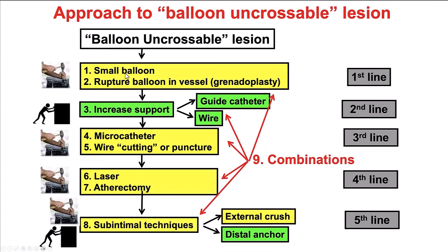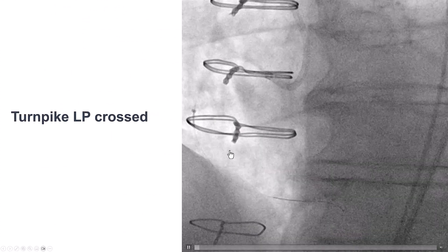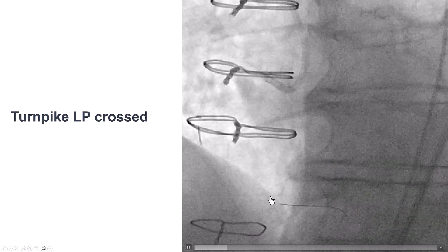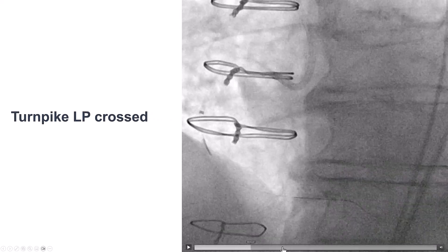The first step is to use a small balloon, then increase support. In our case, we used a 1.0 Sapphire that successfully crossed, so we predilated the RCA, and then the microcatheter — the same Turnpike LP microcatheter — could be delivered.